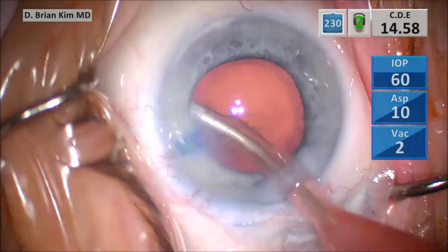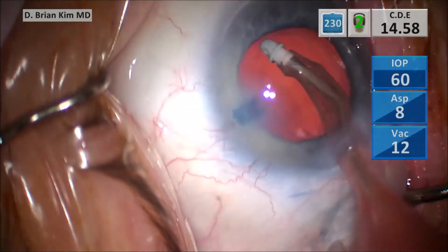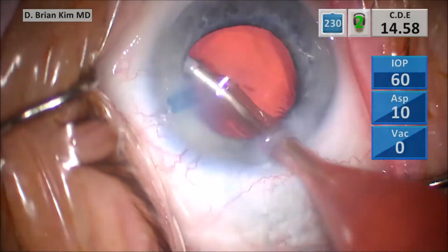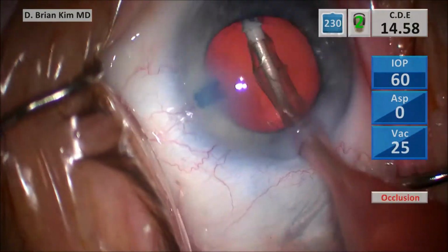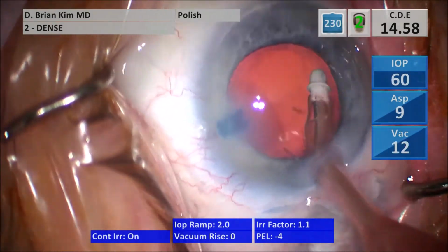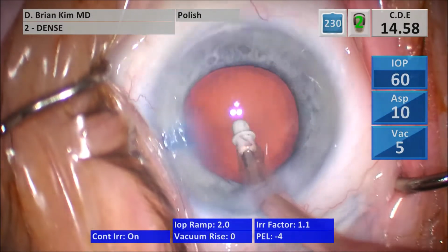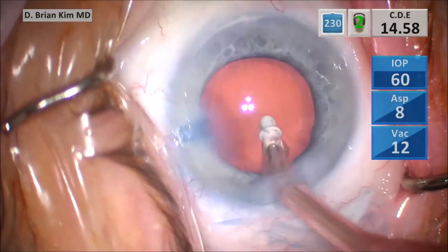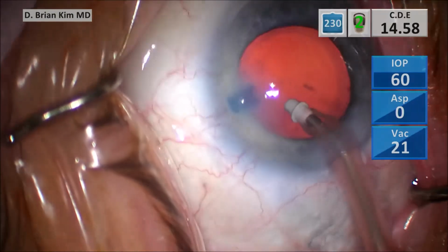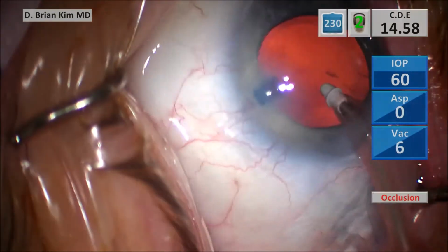You might see some stringy things, but it might be attached to a bigger thing in the capsule fornix, which you can't see. So it's important to go after that stuff, because if you ignore that stuff, what'll end up happening is you'll be that patient that has that giant Soemmering's ring, and you're wondering, golly, why is all this stuff in here? And that's because you didn't polish deep into the capsule fornix. Remember, you can't see that.